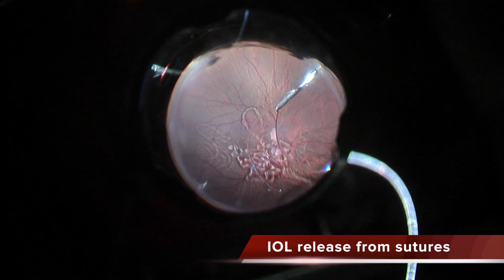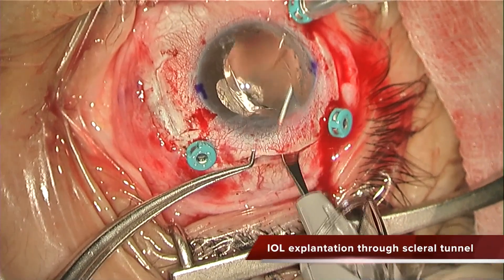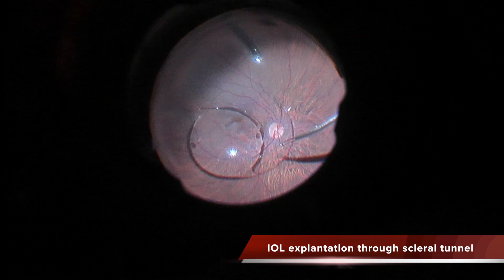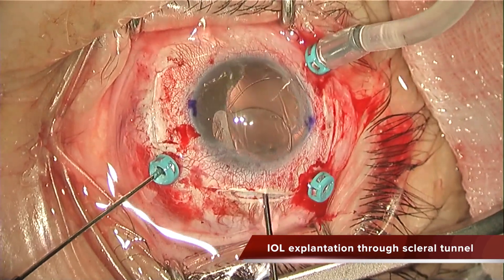Now I'm pulling the lens in and protecting the macula with viscoelastic because the lens is going to fall down. These PMMA lenses have to be removed through a scleral tunnel, and that's why I'm doing this and taking it out.